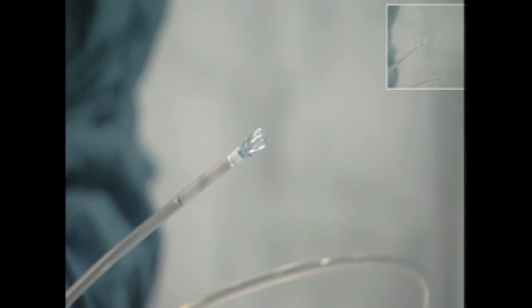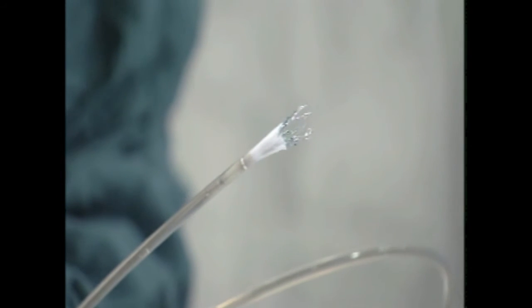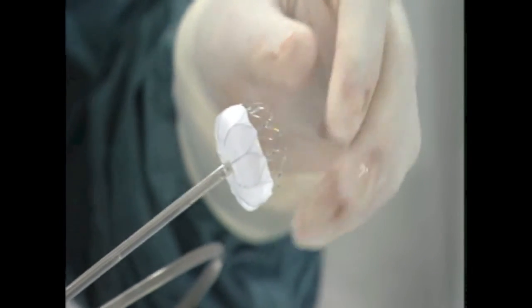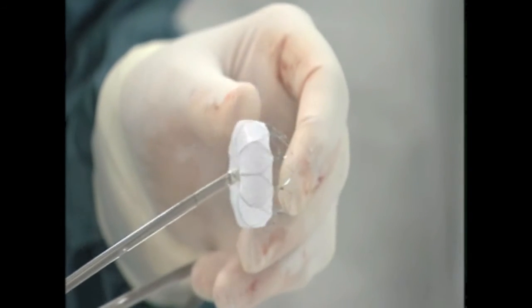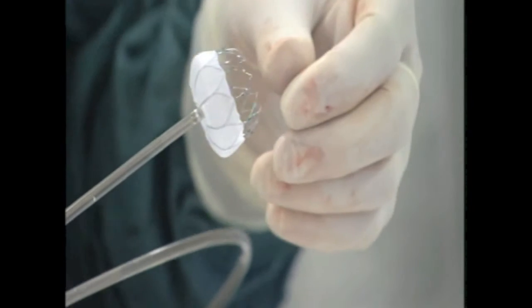Okay, so I'm just exposing the device now, I think 40, and you will see that it opens up suddenly. You can see the hooks are right here, so we have coverage. About 50% of the device is covered by the membrane, and as I said earlier, this is a semi-permeable membrane, which means blood goes through until it's covered by tissue.